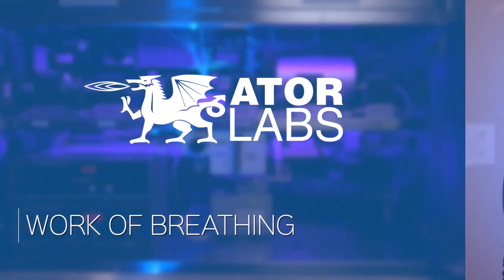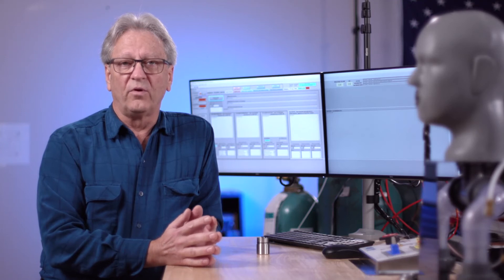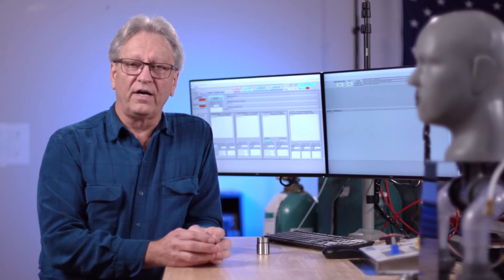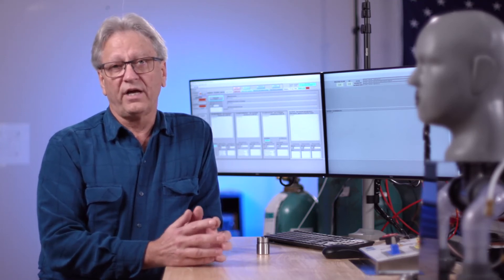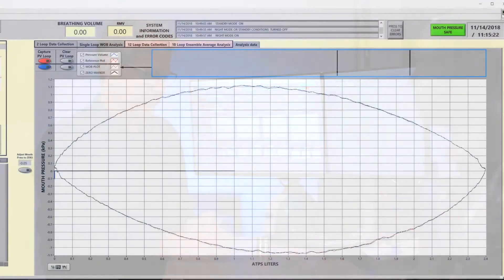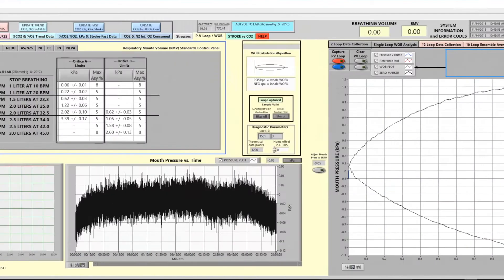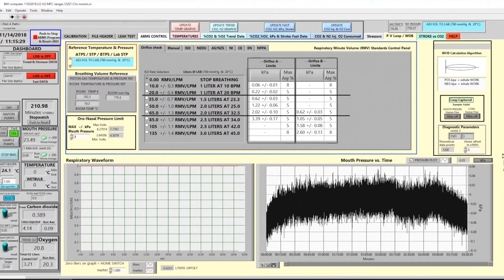In this video segment, we're going to explore a bit more of what the work of breathing capabilities are and how we verify that we match the ISO 16900 standard. Within our system, if we select the PV loop tab, we'll see the analysis screen on the right and the control on the left screen.